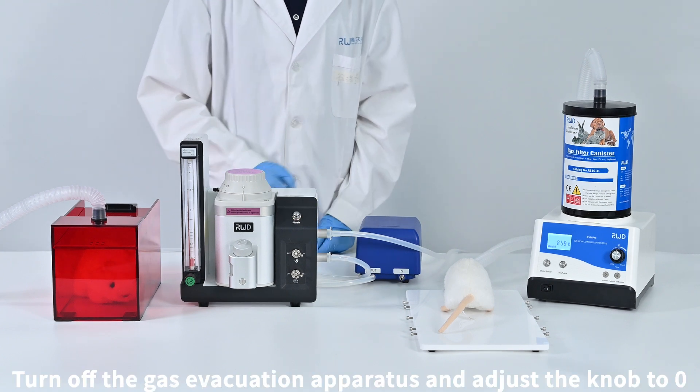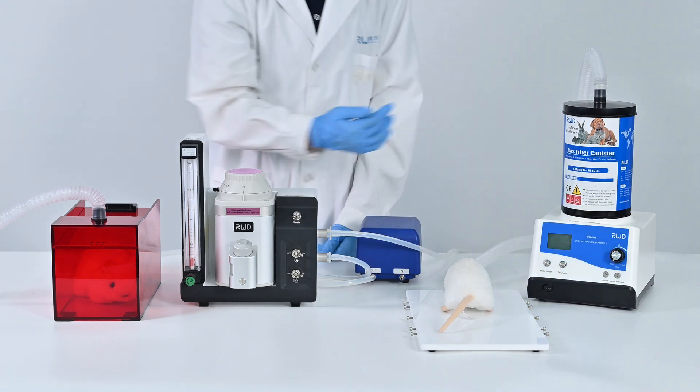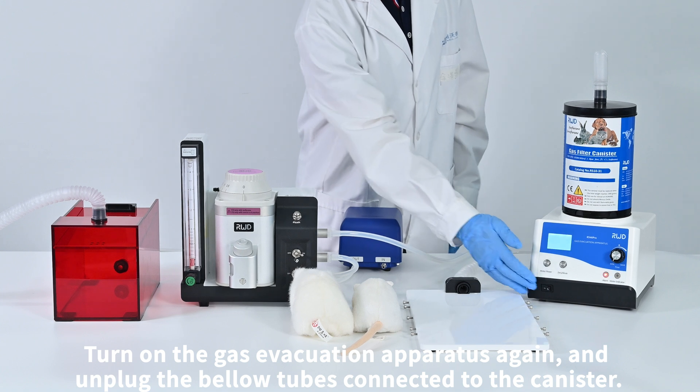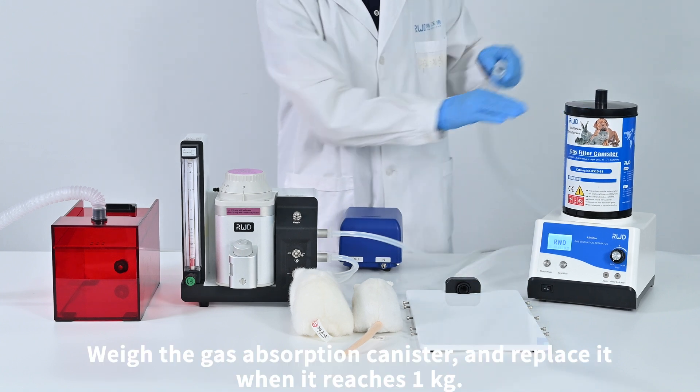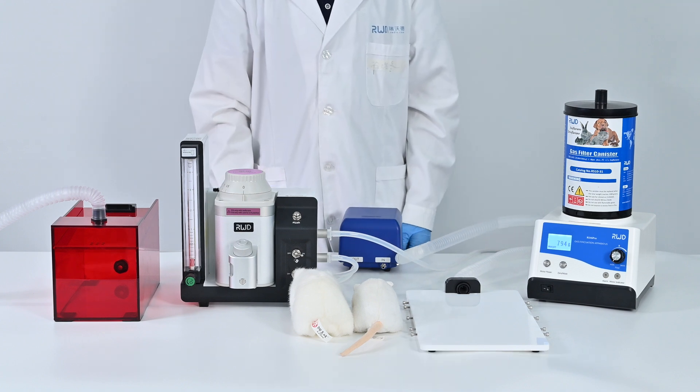Turn off the gas evacuation apparatus and adjust the knob to 0. Then turn on the gas evacuation apparatus again, unplug the used gas absorption canister, and replace it with a new one when it reaches 1 kg.